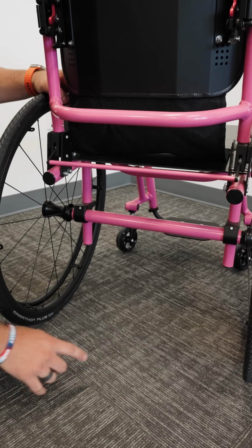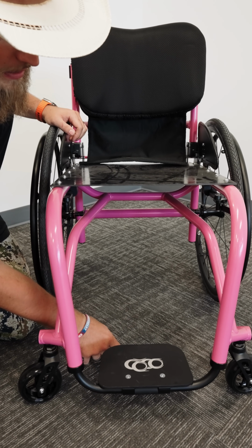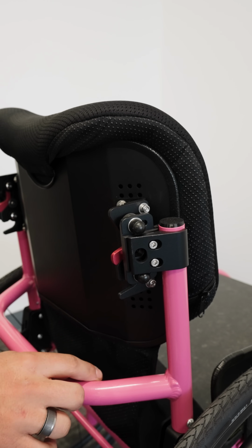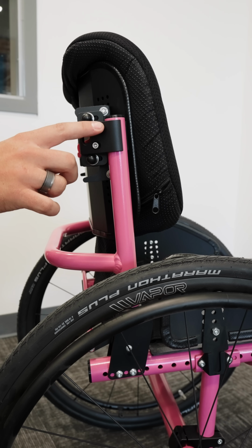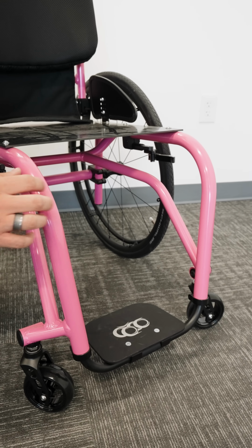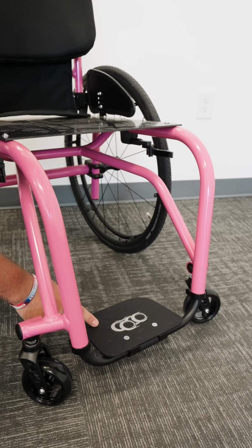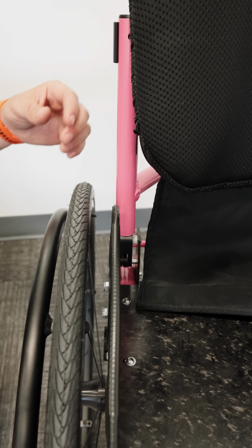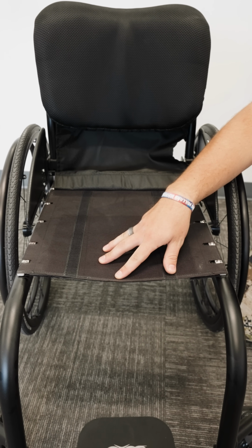Our first measurement that can be adjusted is your rear seat height. Next we have your front seat height. Next we have our center of gravity. We have backrest height and your backrest angle. Then we have your backrest position, backrest height, and backrest angle. Then we have your caster angle. Next we have our seat to footrest measurement, as well as our foot plate angle. Then we have our clothing guard adjustments, our rear wheel spacing, and then lastly we have a seat tension adjustment.